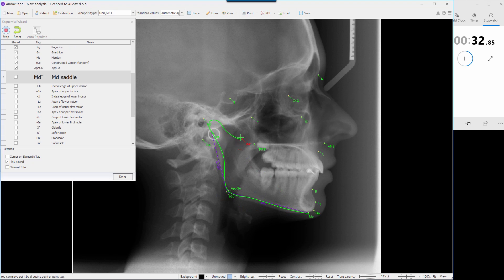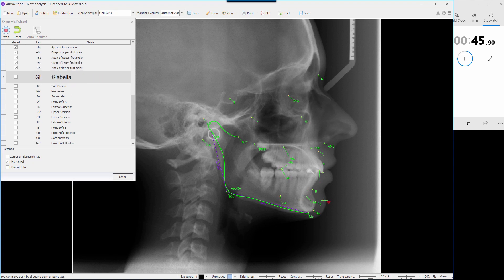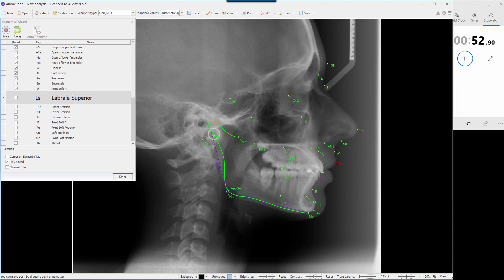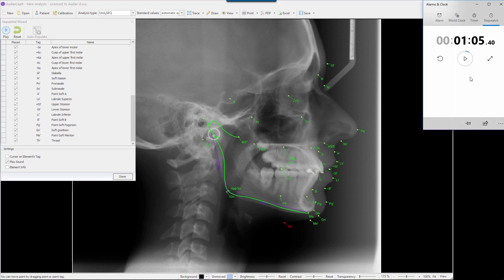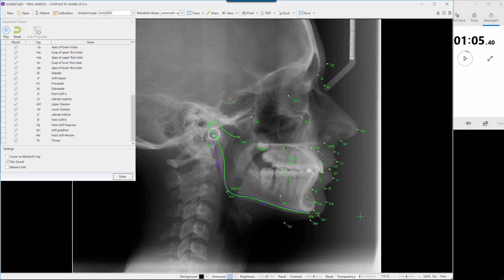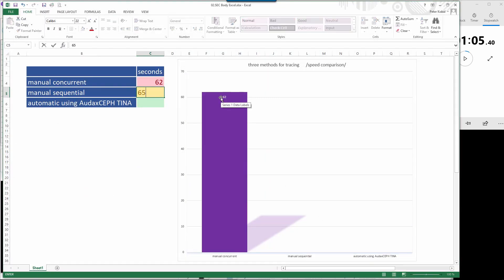Mandibular notch, upper incisor tip, upper incisor root, lower incisal tip, lower incisor cusp of apex, cusp of apex of lower first molar. Glabella, soft tissue, pronasale, subnasale, soft tissue labrale, stomion superius, stomion inferius, labrale inferius, soft tissue B point, soft tissue pogonion, soft tissue menton, throat point. I am done — so I have 65 seconds. It's about the same result.